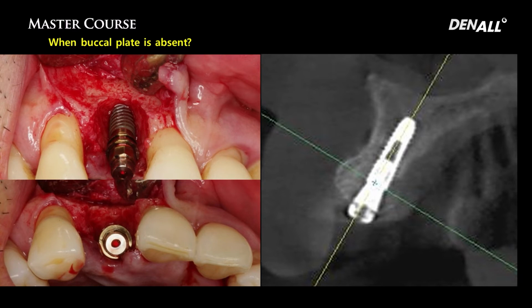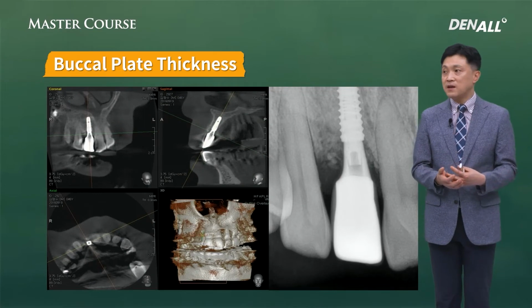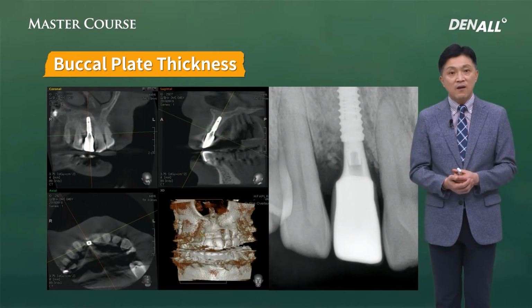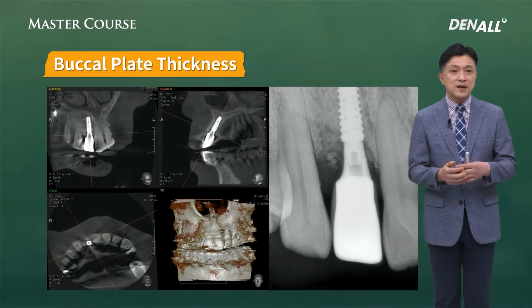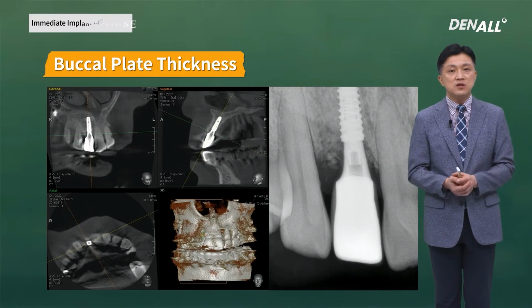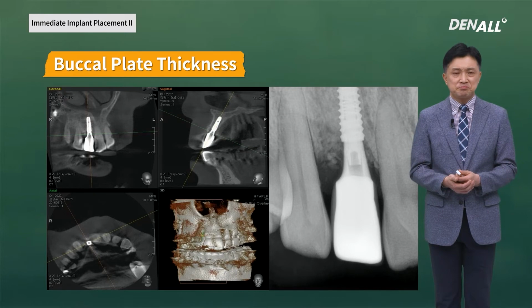It looks as if augmentation has been done significantly, but once it goes through the remodeling process, because in the upper anterior area the amount of remodeling is significant, you need to use rigid membrane and do overgraft to withstand remodeling.